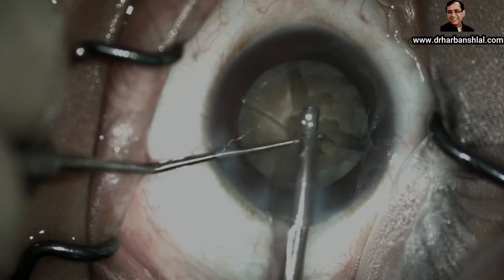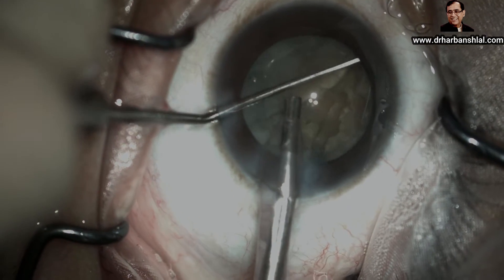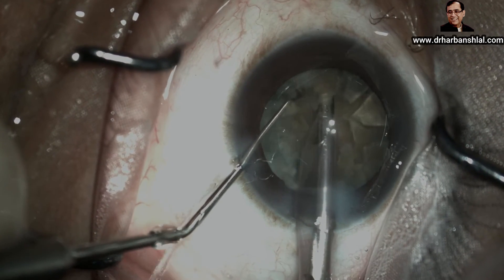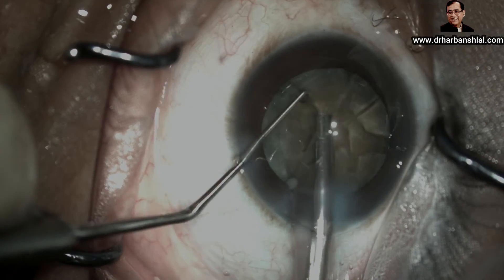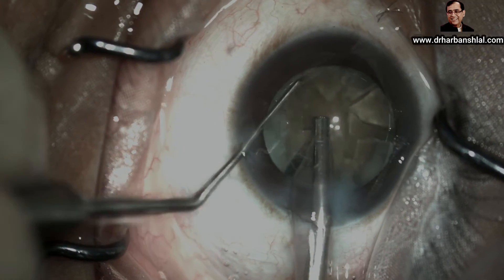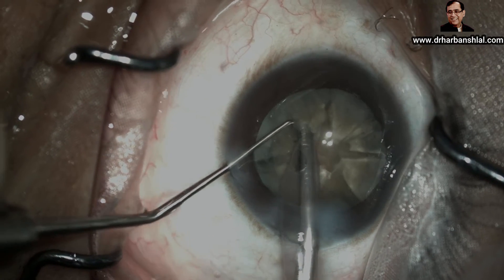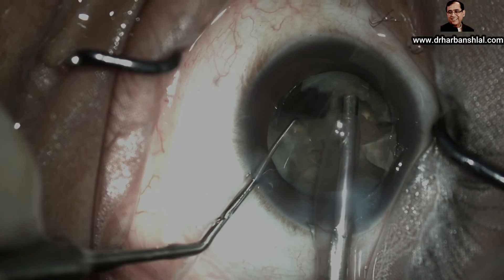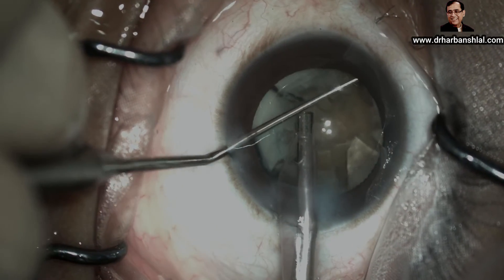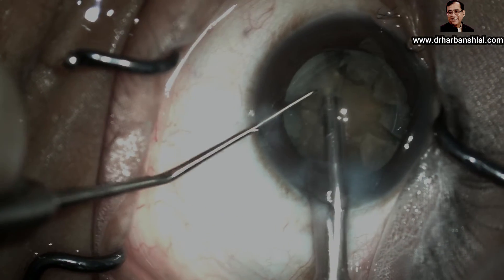The process is repeated and we get another split going behind the nucleus. Now we will rotate the nucleus and create a few more splits into the exonucleus. The whole of the exonucleus is divided and it produces a flower petal appearance, while the endonucleus throughout is left intact. You can see that the exonucleus is going behind the endonucleus — it may not be reaching the same center and may be attached there, but that makes no difference to the final outcome and can be handled later. We are now more or less through with the splitting of the exonucleus.